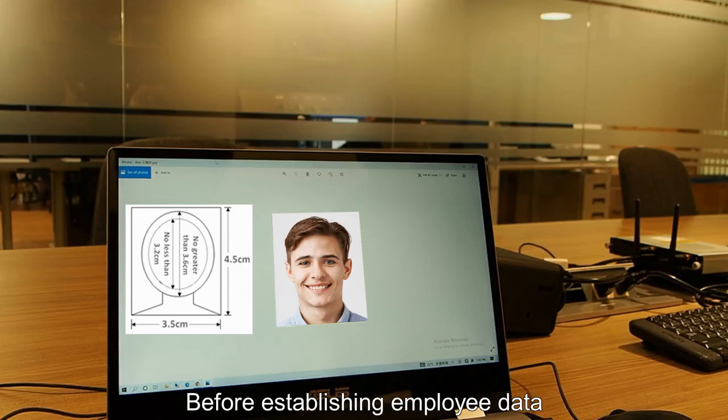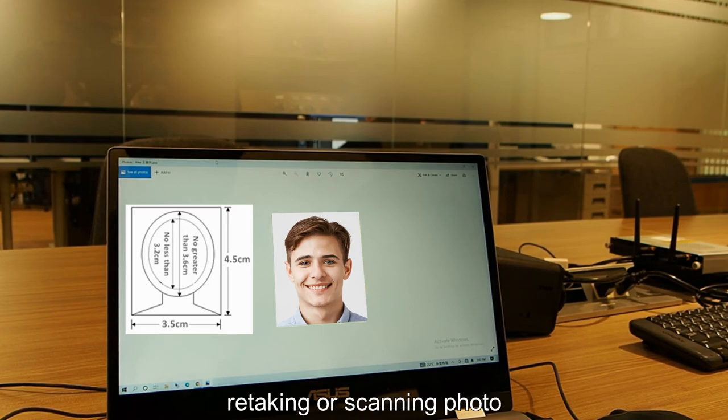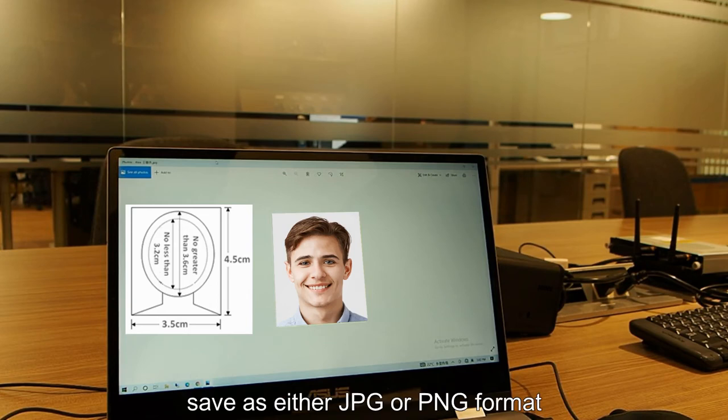Before establishing employee data, please complete the employee's face photo by taking, retaking, or scanning photo. Then crop the front face portion and save as either JPG or PNG format.